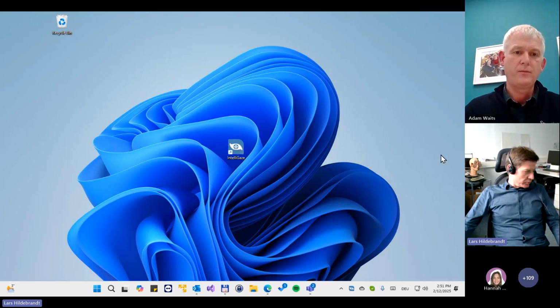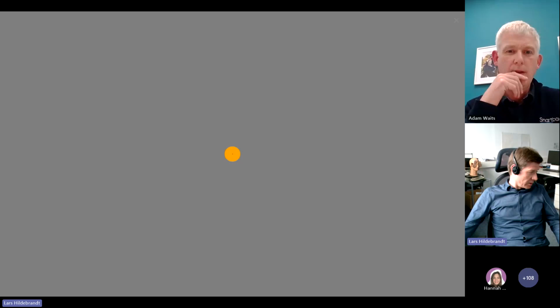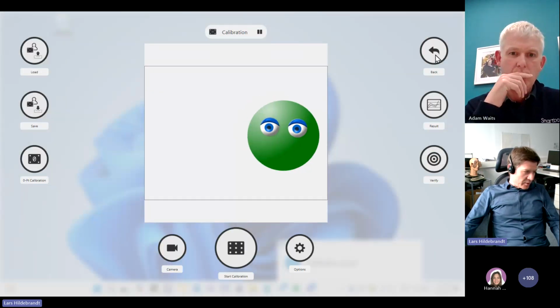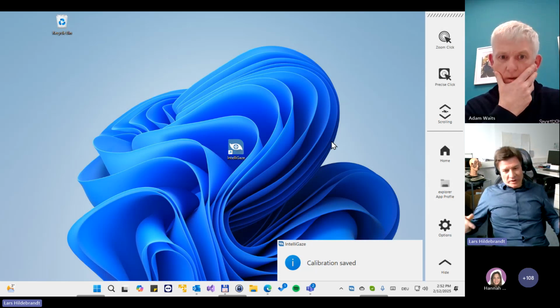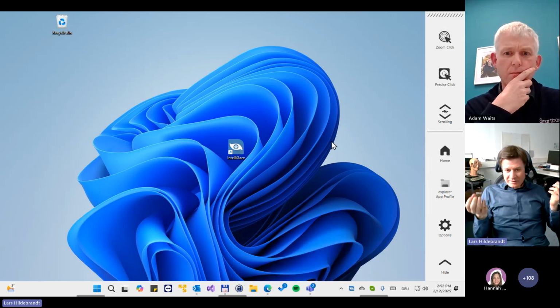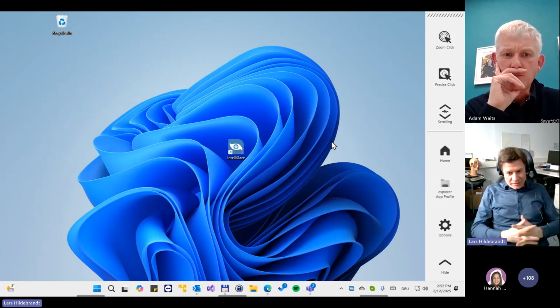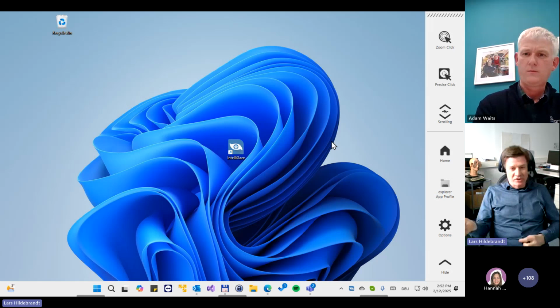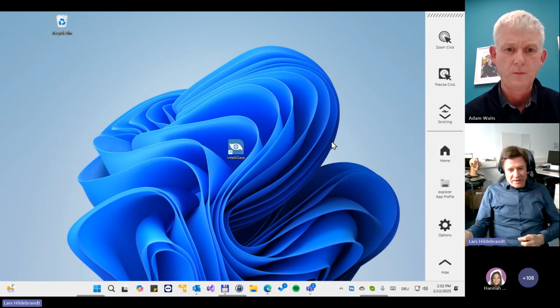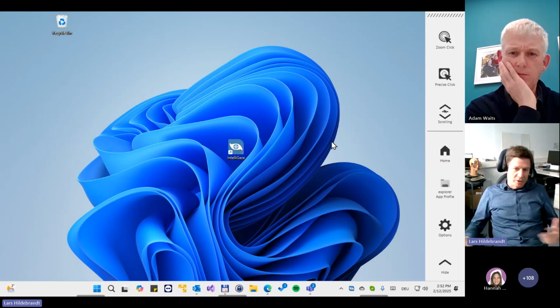Yeah, you can always start a calibration, and it does a new calibration. And I mean, you will notice that you can even share calibrations between users, if the eyes are similar, then it would perfectly match. However, we are all individuals, and therefore there can be deviations between users. But sometimes I have seen users where mom was calibrating and the child was using the calibration.